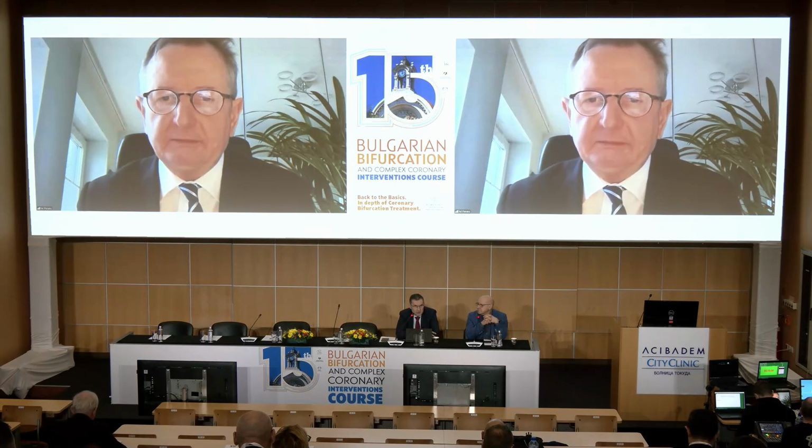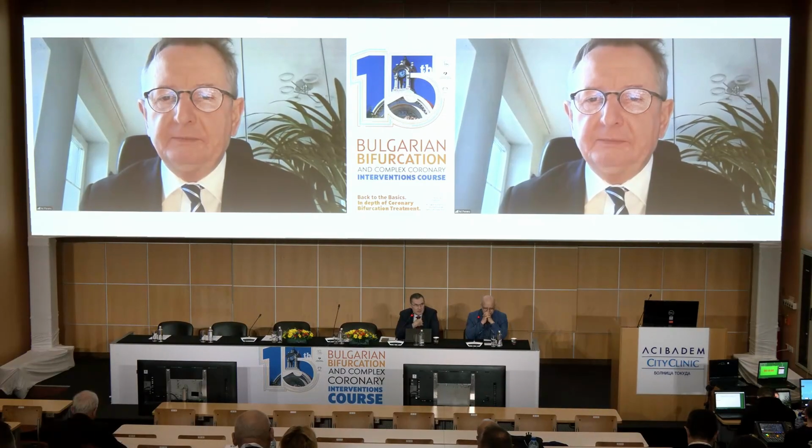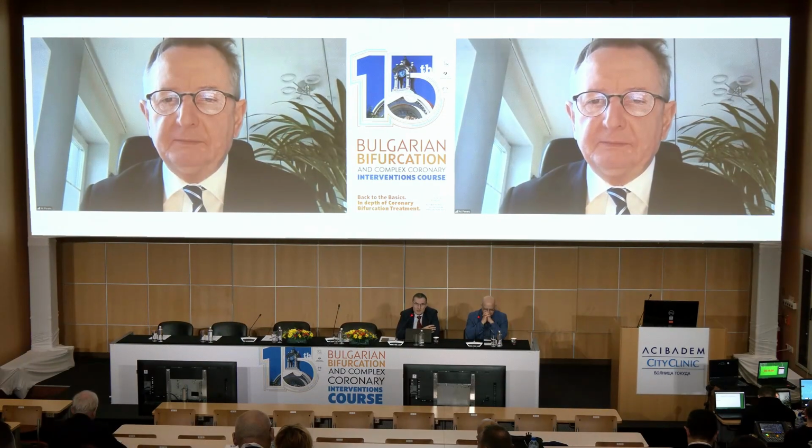Yeah, this is a very good and clear message, because I saw in the past many use 1.25, which is not safe. I personally started that way in the past, but in the last 6 or 7 years I'm doing more than 90% of my rotablations with 1.5.